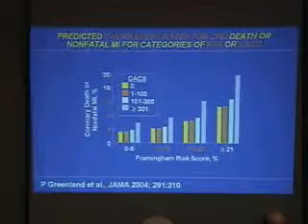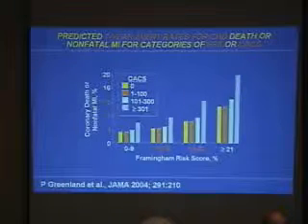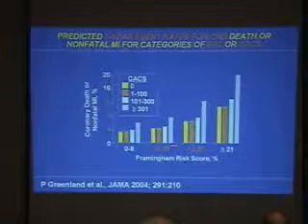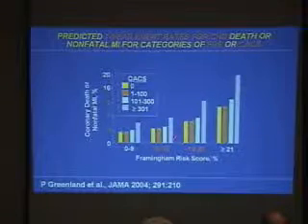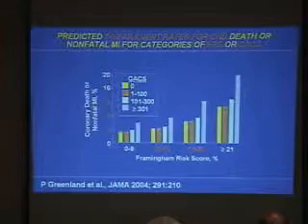And this is other data from the calcium scoring, from Greenland, just published 3 weeks ago, where you can have the Framingham score intermediate here, from 10 to 20%, and now you have a calcium score of more than 300, and over a 7-year period, you are already moving towards a high-risk patient.